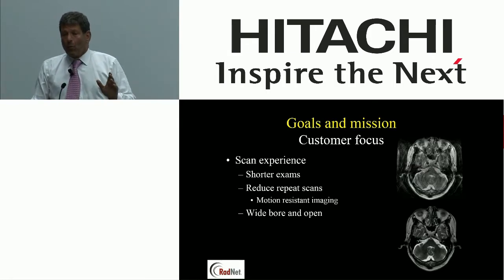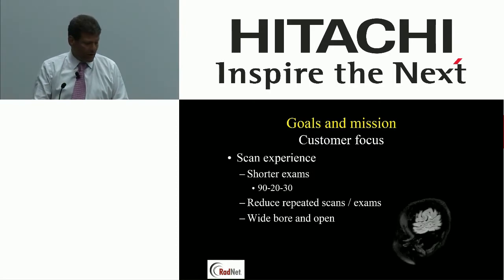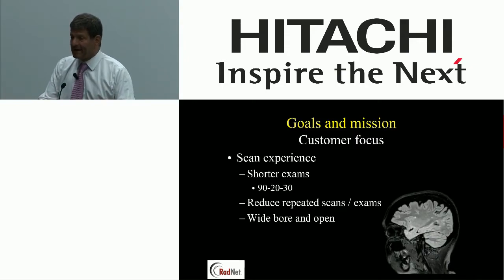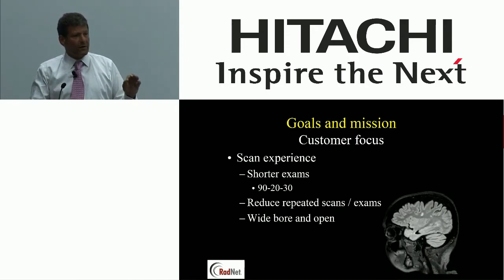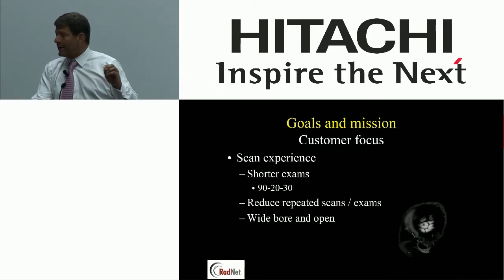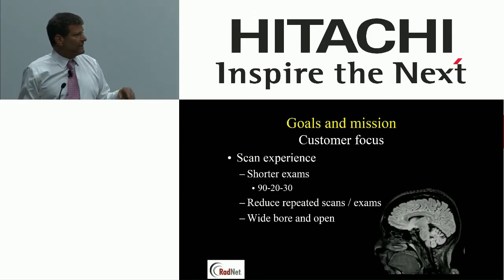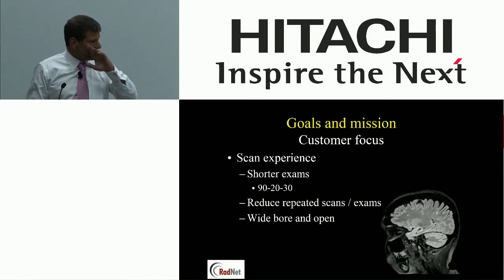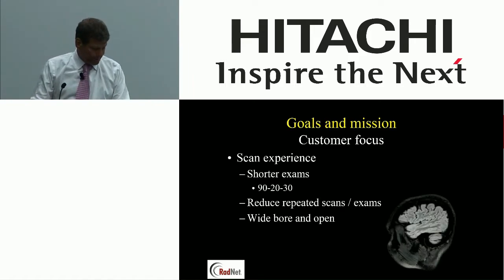Ultimately, what I'm trying to do is shorten the exam experience. We've talked about making it more consistent, but I want shorter exams, okay? Our goal a couple of years ago was to get 90% of our exams under 20 minutes on and off the table, pretty much, without contrast, and maybe get to about 30 minutes on and off the table with contrast. And we're close in those circumstances across our scanner platforms.